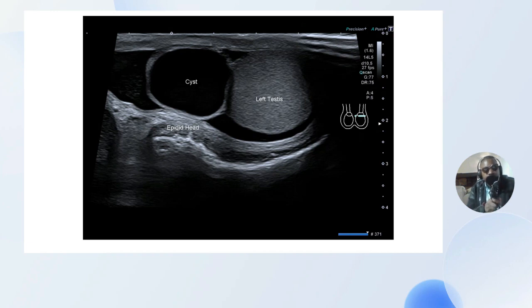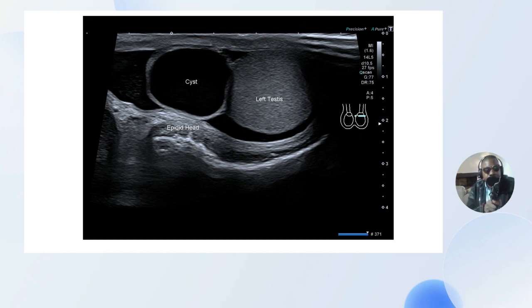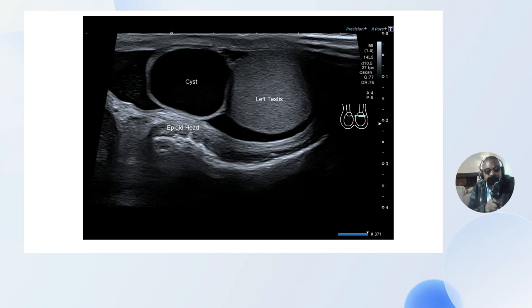Let me take you to the case today — this is a case I came across at our department. What we have here is the left testicle, and you can see around it there's a little bit of free fluid, though not much. Here at the head of the epididymis you can see a well-outlined cyst, and if you look inside you can see it's clear — it contains clear anechoic fluid with no internal content.